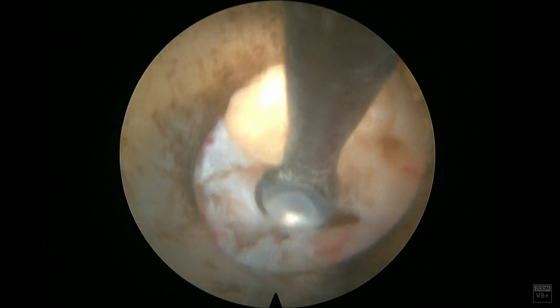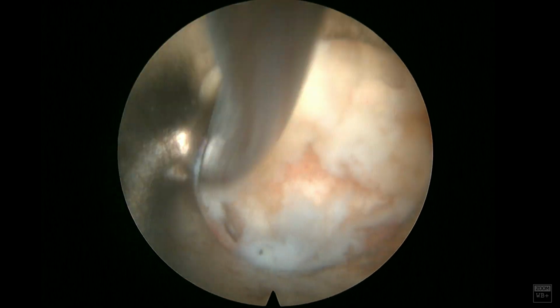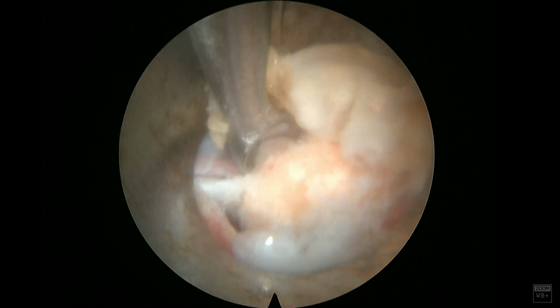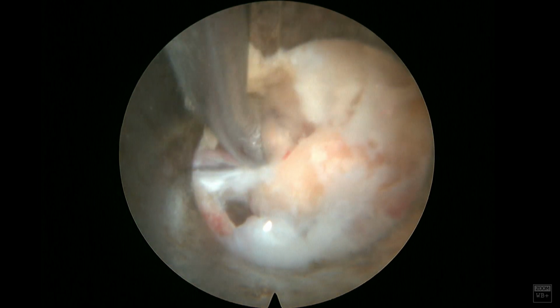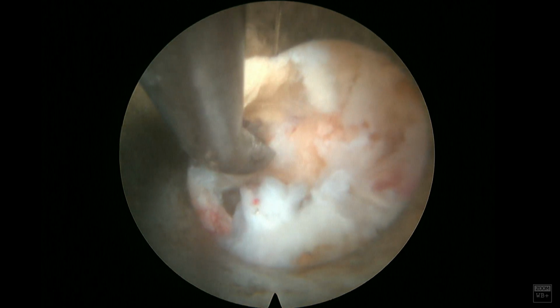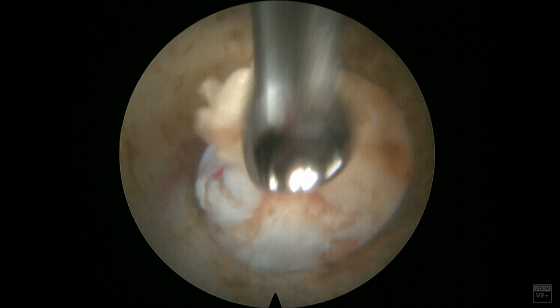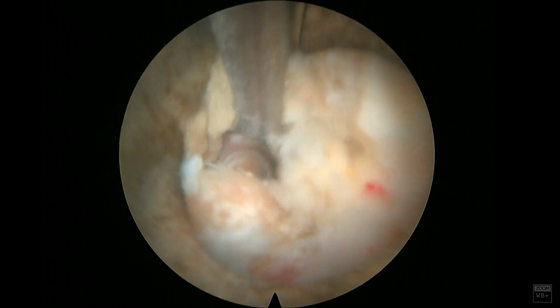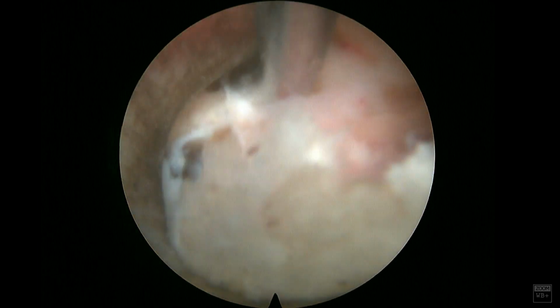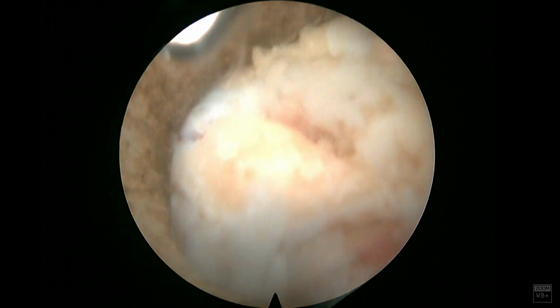The curette is a great tool to use during endoscopic spine surgery. So here I use the curette to remove some of the ligamentous attachments to the osteophyte. Again, the dura is right there on the side, so I want to make sure I remove any adhesions from the dura to the osteophyte. This can be a little bit dangerous, as you want to make sure that you don't get a dural tear when you're doing this. That's why I come in from the side here, and I try not to pull it too much, but use more of the sharp edge of the curette to remove the osteophyte.